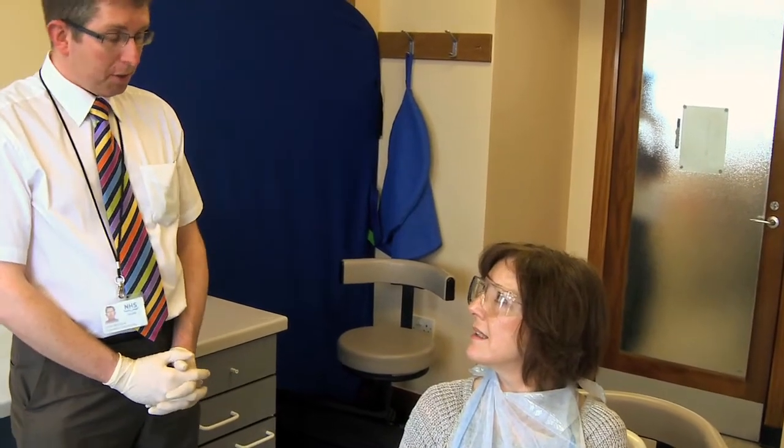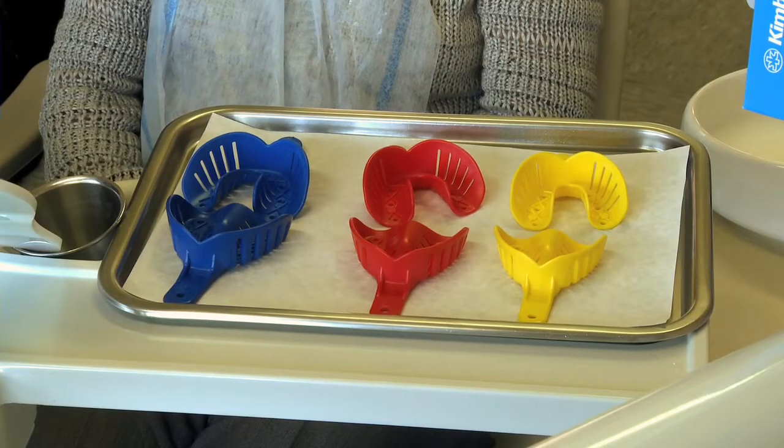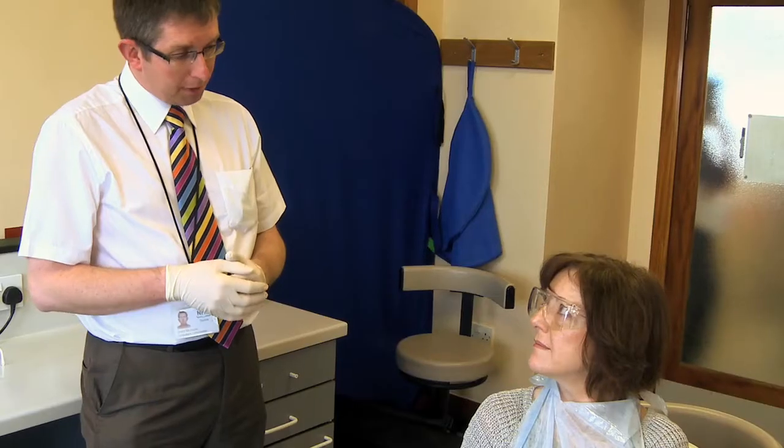We're going to take some impressions of your top and bottom teeth today. So what I want to do first of all is to have a look at your mouth, and we've got some impression trays here. We want to check which one is the right size for you, and then we'll take the impression and then we'll check how it looks after that. Okay, so can I have a look at your teeth first of all?